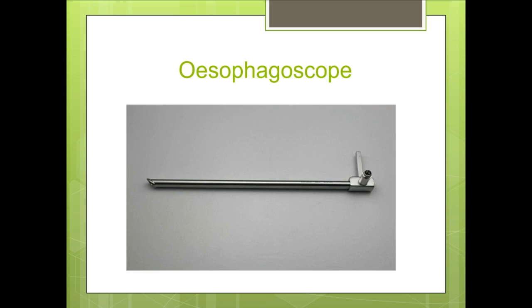There is one more type of esophagoscope, that is the flexible esophagoscopy. To examine the esophagus and rule out any pathology in the esophageal region and the stomach, the flexible one is used by the gastroenterologist.